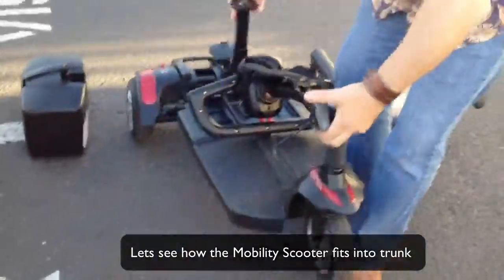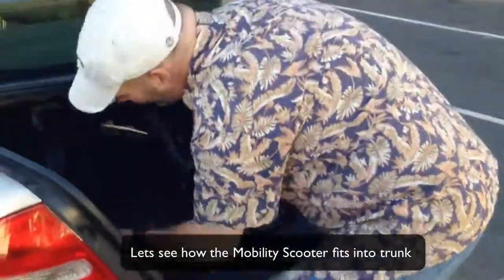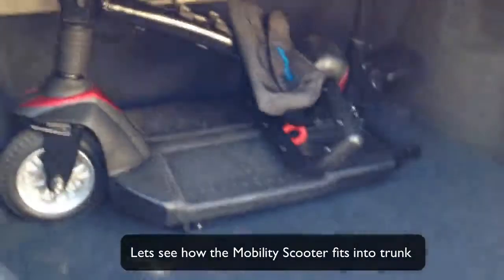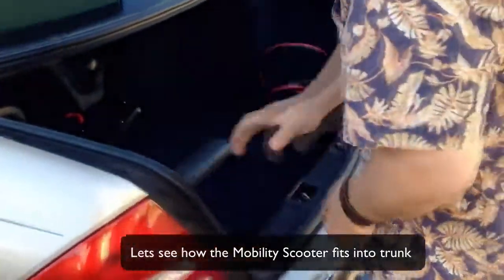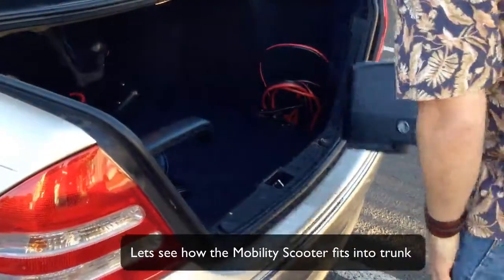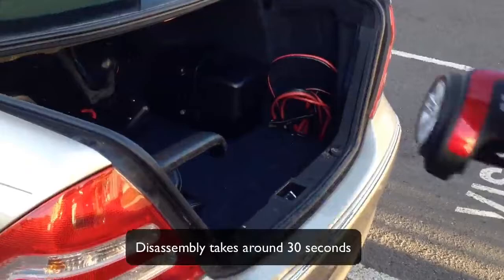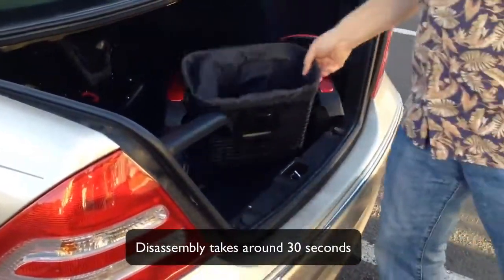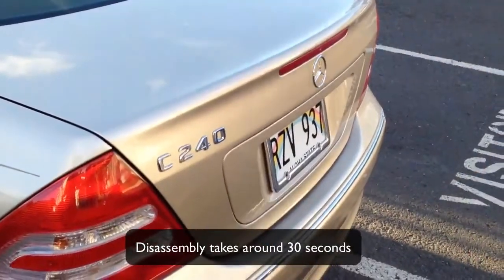Let's see if we can get this up into the trunk and if it fits pretty well. Look at that — it does! Scooters have been in my trunk many, many times. In goes the seat, in goes the battery pack, in goes the transaxle — which conveniently has a handle — and the basket. Boom! You are ready to go wherever you wish to in Hawaii.